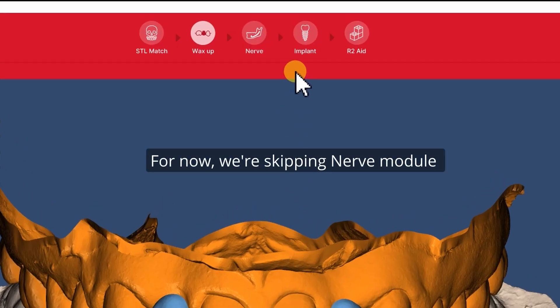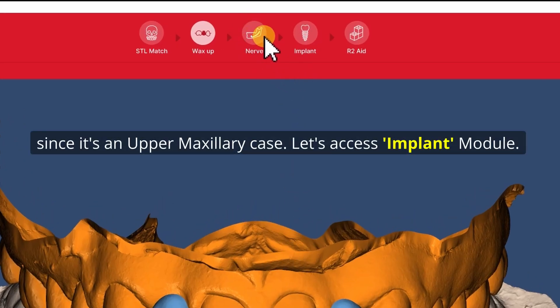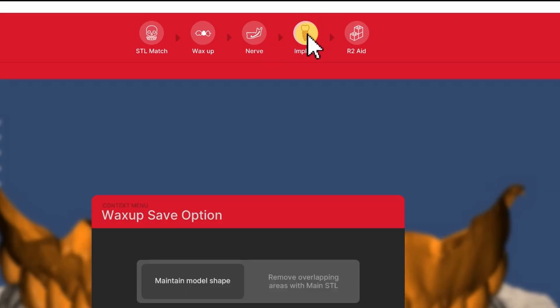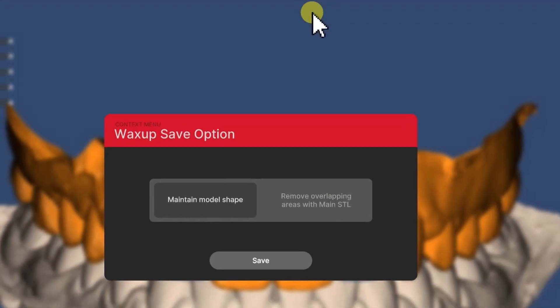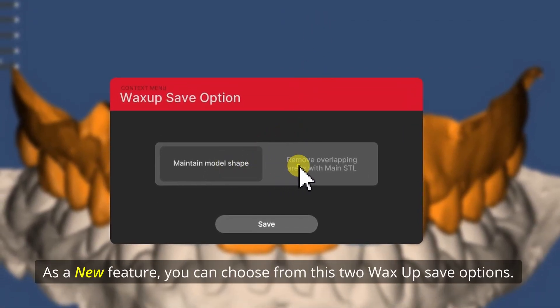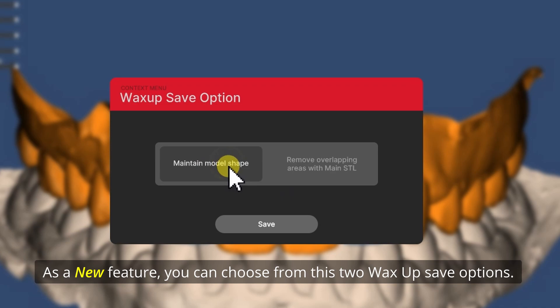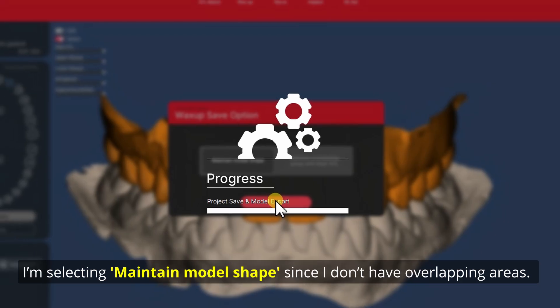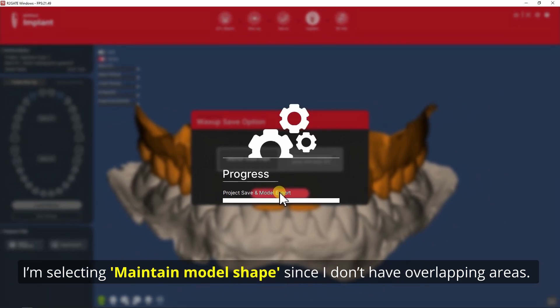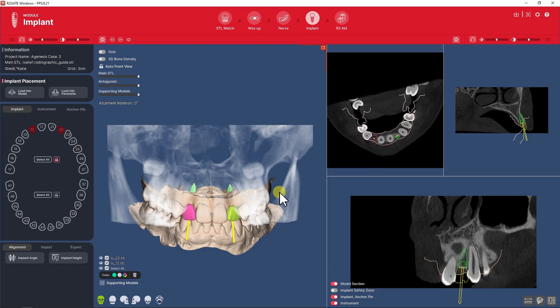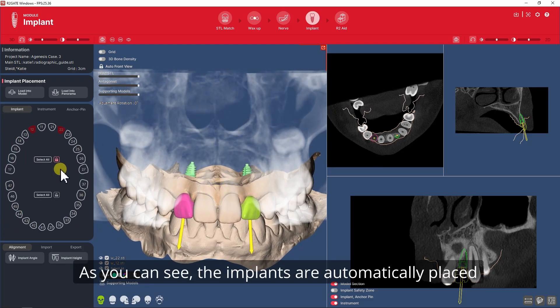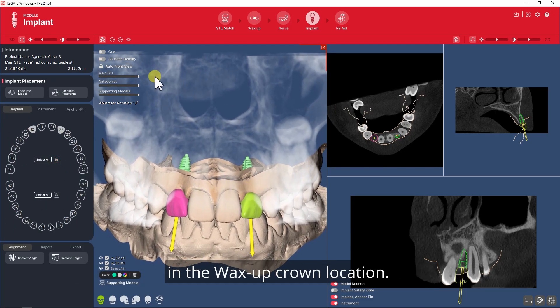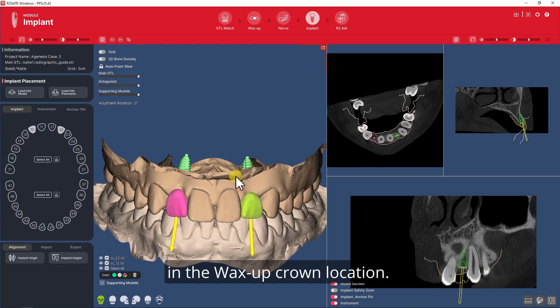For now we're skipping the Nerve module since it's an upper maxillary case. Let's access the Implant module. As a new feature you can choose from these two Waxop save options. I'm selecting Maintain Model Shape since I don't have any overlapping areas. As you can see, the implants are automatically placed in the Waxop crown location.